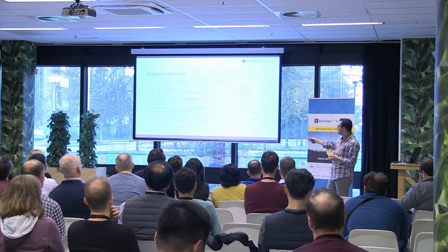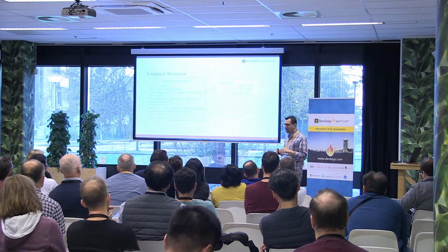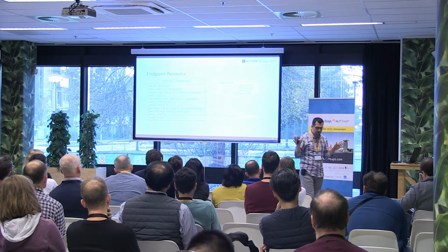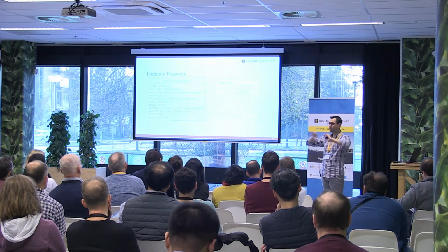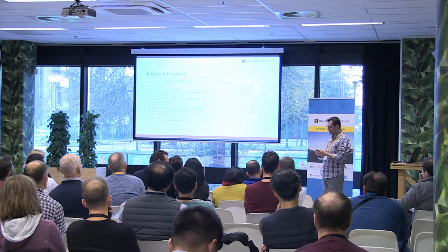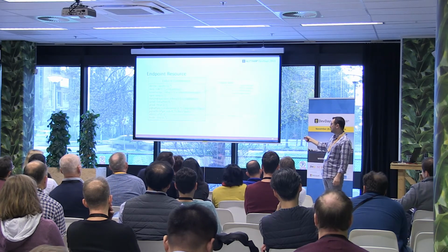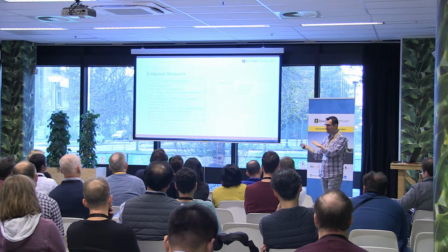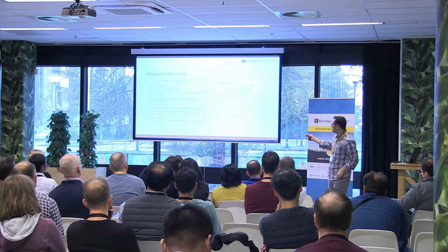This is an IHE profile called Invoke Image Display, which basically says, hey, if I have a system and I really don't care for handling DICOM, I just want to be able to give the user a link, send them somewhere where they could see the study and interact with it. That's the one right here. I don't know how many people actually use this in real life, but it is there. I've not seen it. Hopefully you do, but only time will tell.